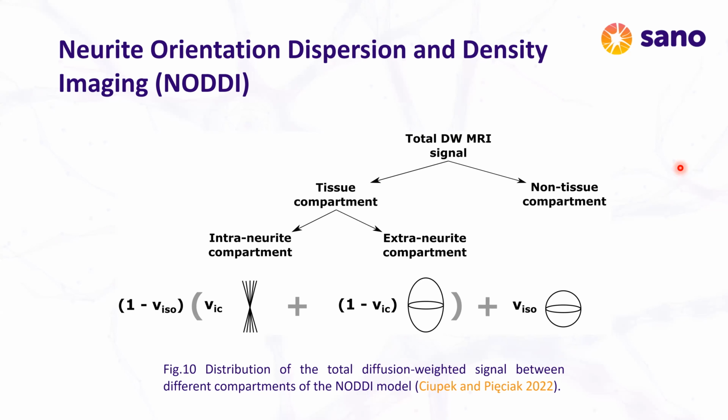The procedure of fitting this model to diffusion-weighted data may be very unstable, and therefore it is necessary to restrict values of some microstructural parameters. However, this may cause incorrect results for some cases. For example, significant differences between the determined values and the values that are actually present in the human brain in case of some diseases will cause false changes in other microstructural parameters that we want to estimate. So they will not correctly reflect the tissue pathology.